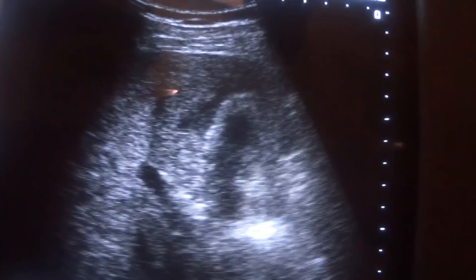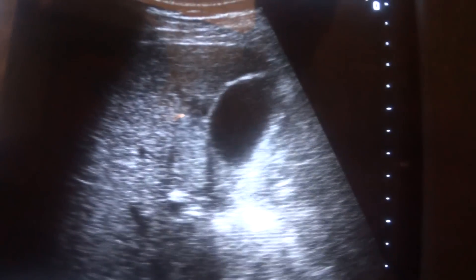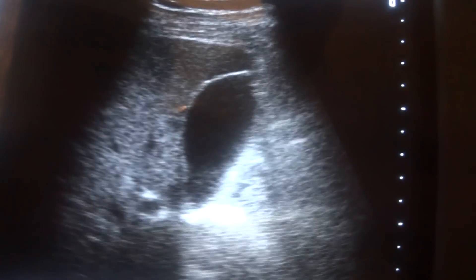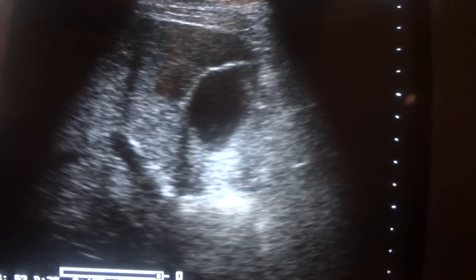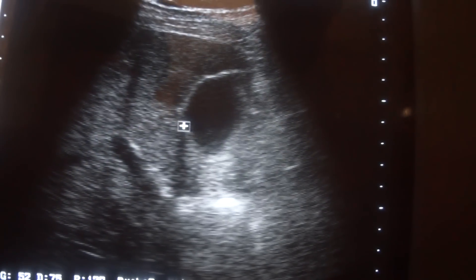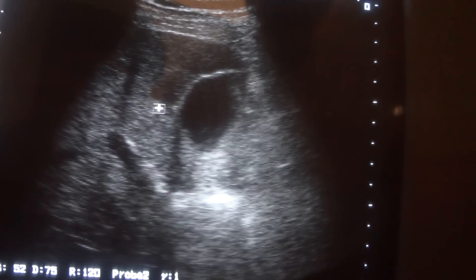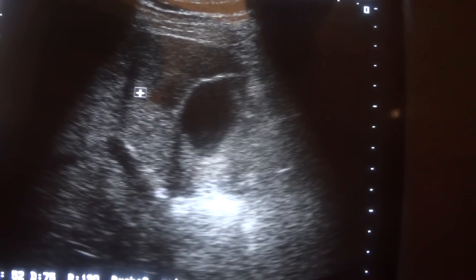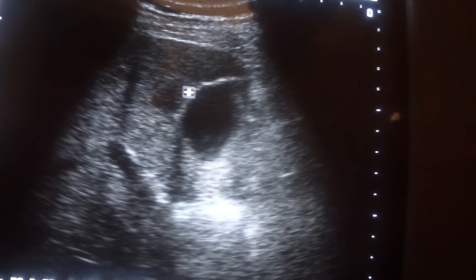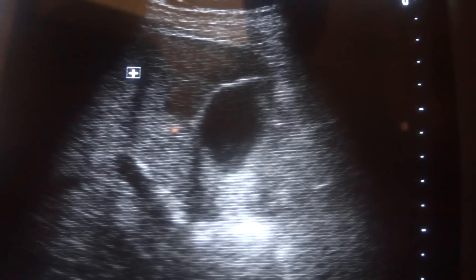In this video segment you are presently seeing the gallbladder with the portal vein — this is the portal vein. This is the gallbladder, lumen clear, and this is a small hypoechoic, ill-defined area adjacent to the anterior wall of the gallbladder. What is this area? You may commonly come across these areas.